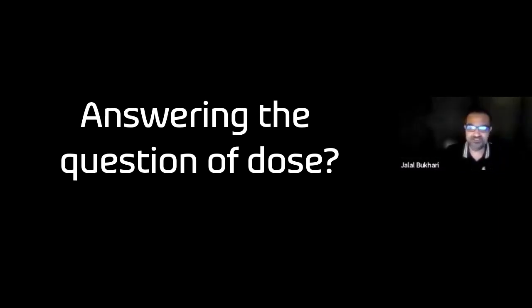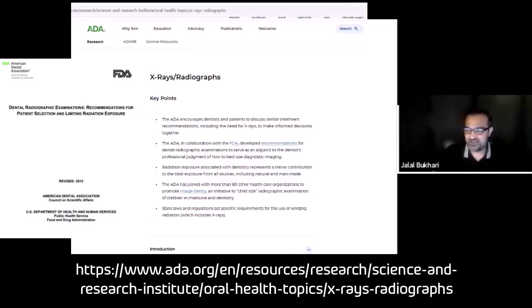One of the resources that I believe we have as dentists is the ADA website. A lot of you may or may not know that the ADA collaborated with the FDA back in 2012 to come up with a paper. They developed recommendations for dental radiographic examinations to serve as an adjunct to dentists on how to best use diagnostic imaging. It's a great resource that every practitioner should refer to, especially when trying to decide what image to utilize or how to limit radiation exposure when using any type of imaging modality.